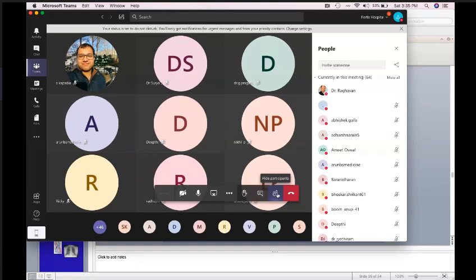Sir, is the four chamber view shallow LAO or steep LAO? Shallow. Four chamber view is typically 30 degrees LAO and 25 to 30 degrees cranial. Okay. Shallow LAO, cranial.